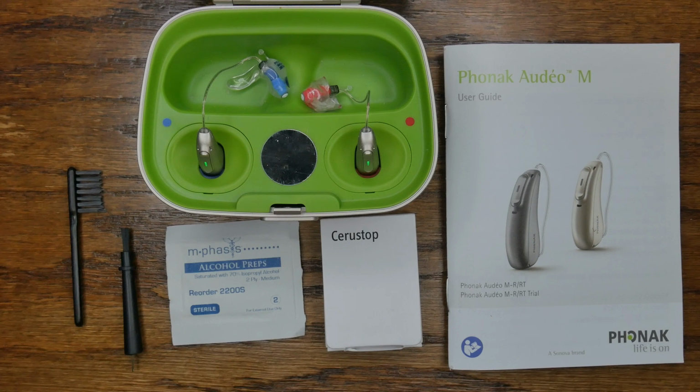The first thing to note with these Phonak Audeo Marvel rechargeable hearing devices is the charging function. When the hearing devices are not in your ears and in use, it is a good practice to place them in the charger. This ensures that the devices are not misplaced or damaged by pets, and also helps to ensure your hearing devices have an adequate charge to carry you through the day.